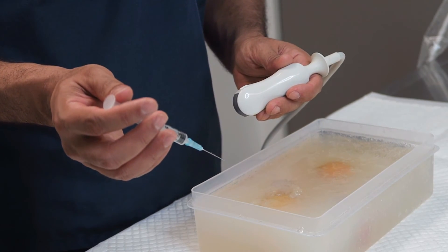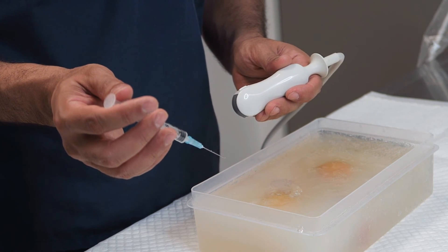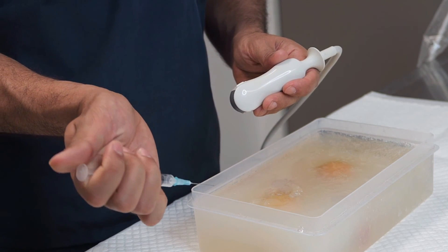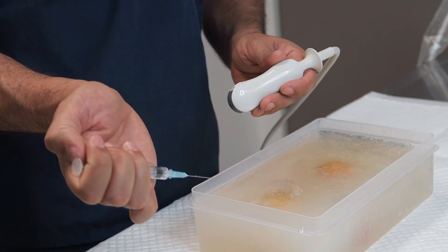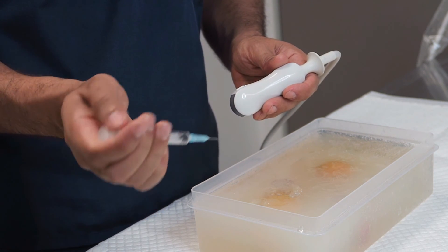One thing I've learned the hard way is to make sure that you always pump your syringe so that it's easier to aspirate.